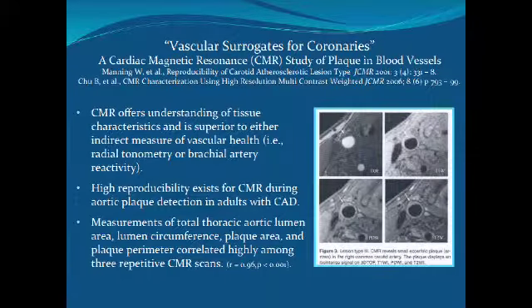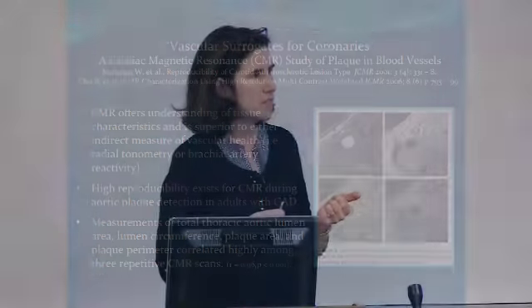So with that in mind, during my course of learning, I became acquainted with MRI. First in industry, when they asked me to be involved with an HDL elevator, and the primary endpoint was going to be MRI, and I knew nothing about it, and yet I was in charge of it. And so I was sent out to meet with Dr. Yuan in Seattle, and he's a radiologist who does a lot of imaging of carotid arteries, and then compares the images by MRI. These are cross-sectional pictures of the carotid artery, and you then compare it with histologic specimens because the patients were undergoing carotid endarterectomy.